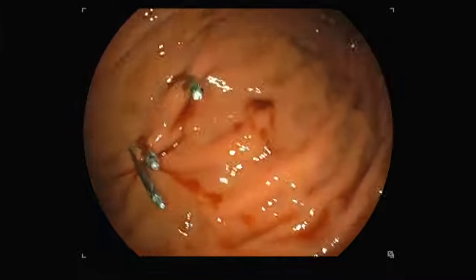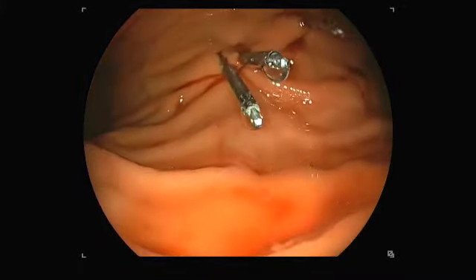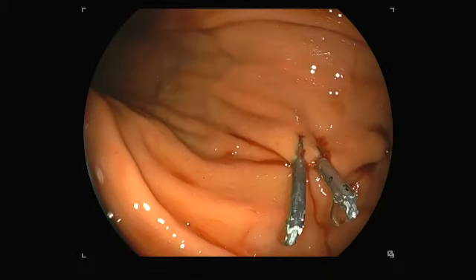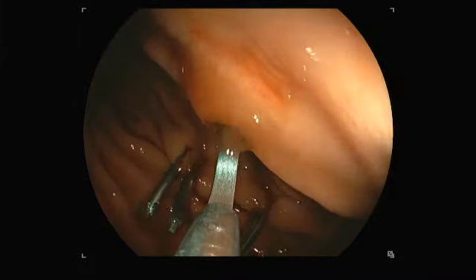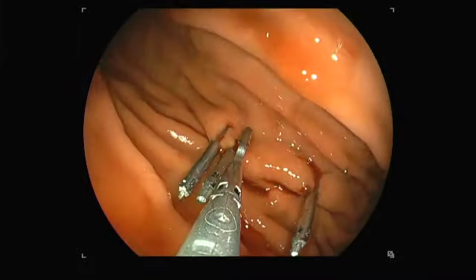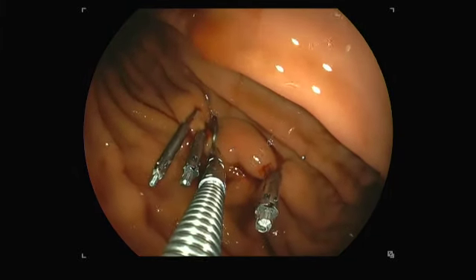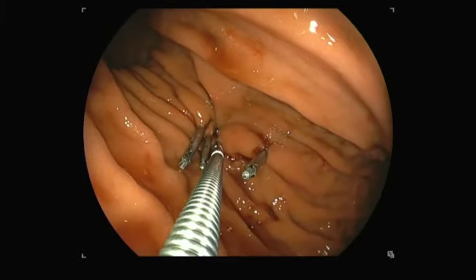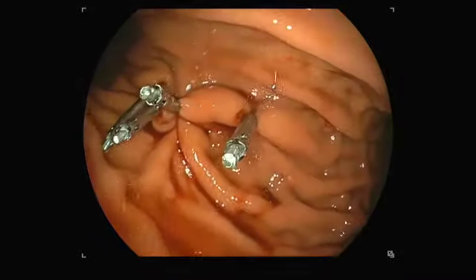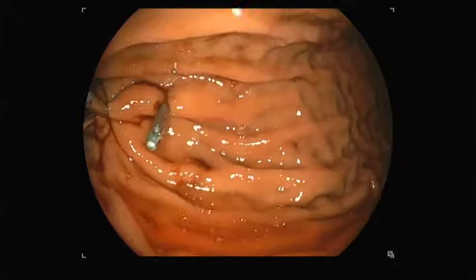In order to do that, what do you want to do next? Options include application of additional clips and where to apply, on the oral side or on the distal side. Because the second bleeding site was controlled easily with a distal clip application, distal to the site of bleeding, we decided to put that additional clip towards that second lesion, and this has worked very well because now we achieved complete hemostasis.